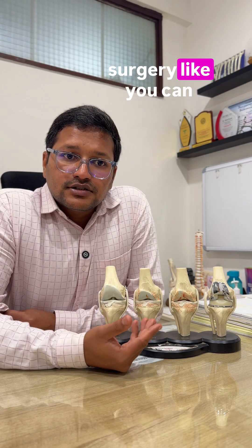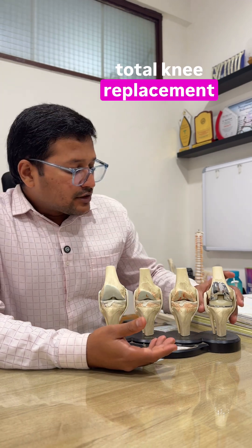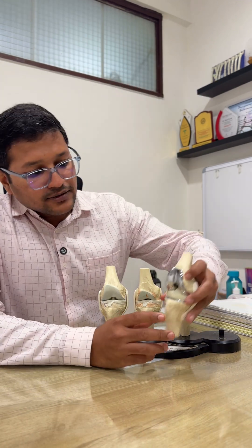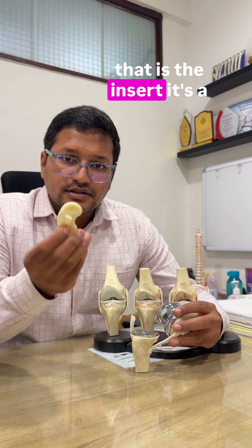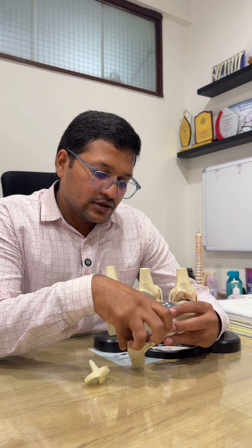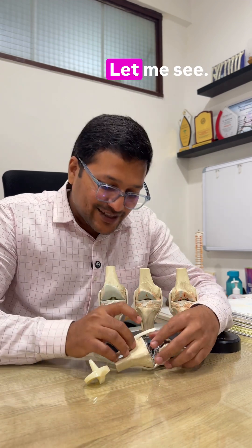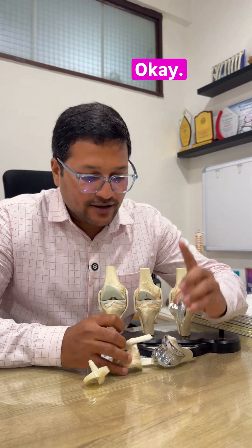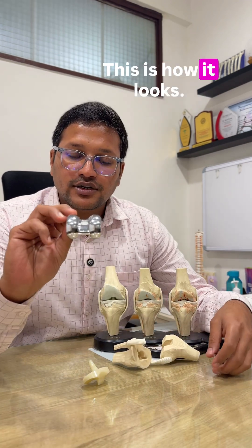If a patient is fit, the most rewarding surgery is a total knee replacement. A total knee replacement usually looks like this — that's the femoral component, this is the insert, a highly cross-linked polyethylene insert, and you have a tibial component here. This is how it looks.